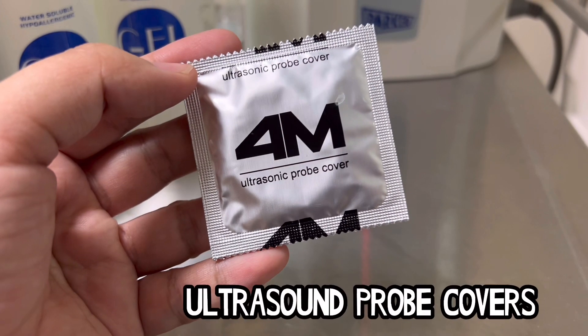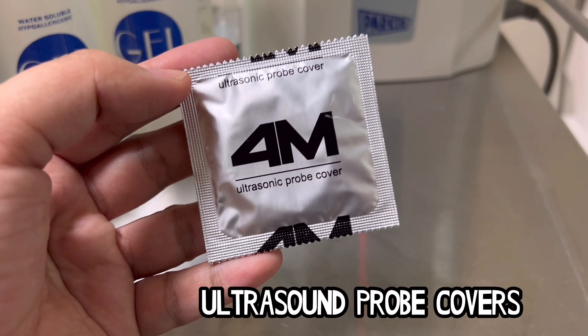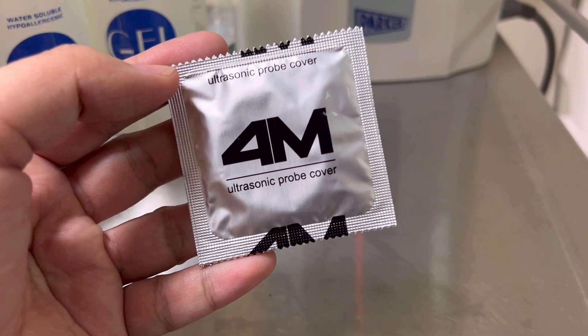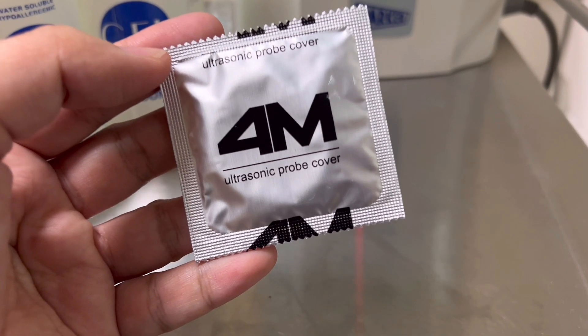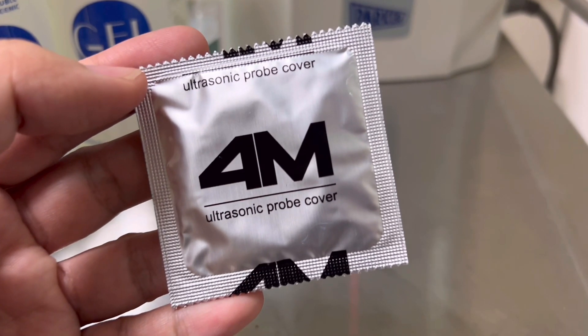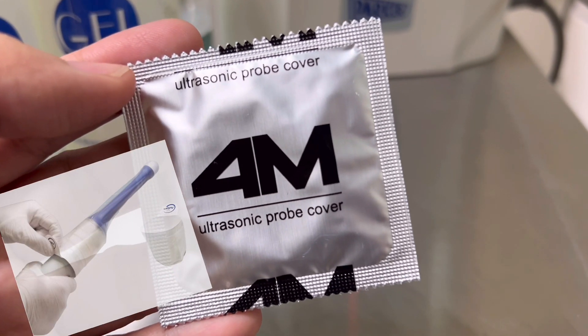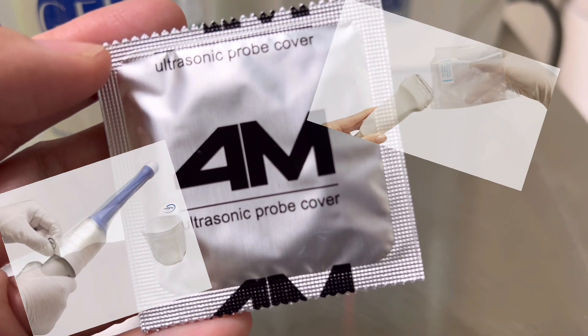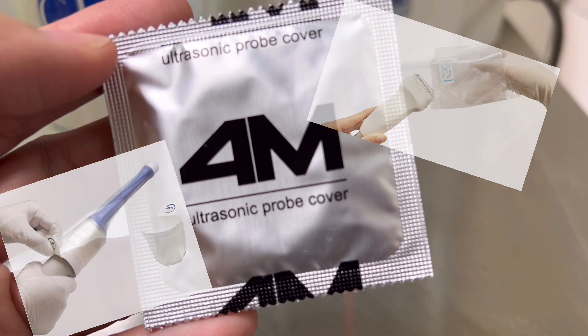Next is the ultrasonic probe cover. Patients, users, and equipment are safeguarded against cross contamination by using these ultrasonic probe covers. This one that I'm holding is intended for transvaginal sonography in radiology, vascular access, pain management, orthopedic, or anesthesiology procedures.